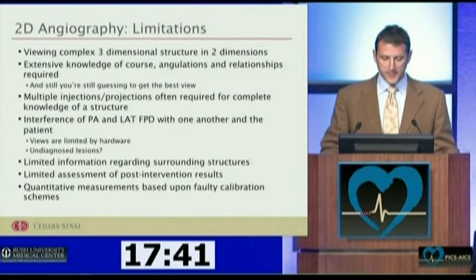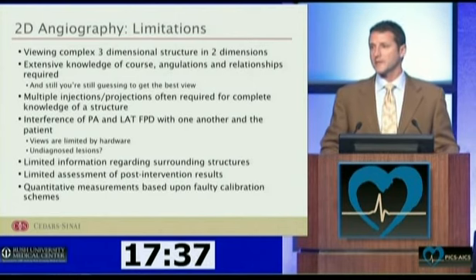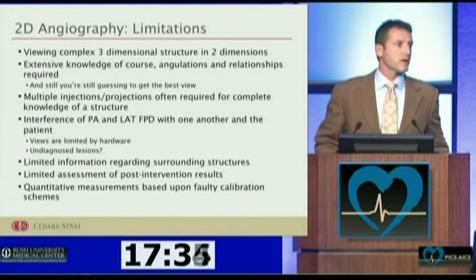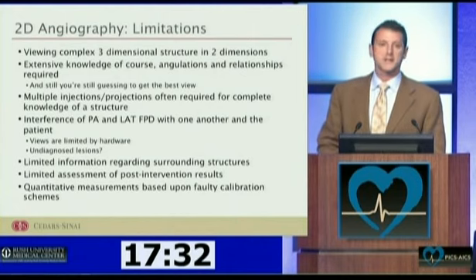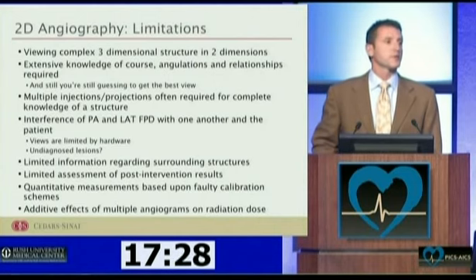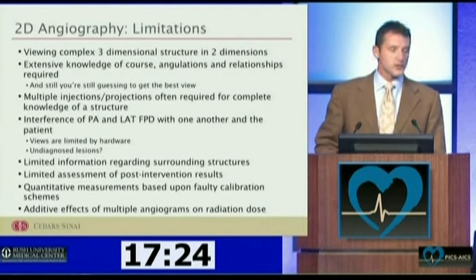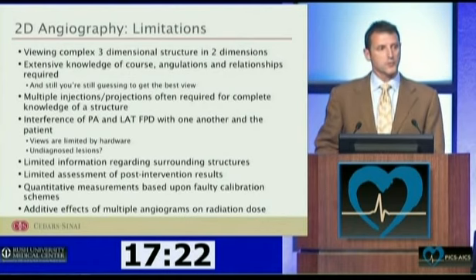Finally, quantitative measurements can be done, but they're based on, I think we could all agree, less than perfect calibration schemes which have been developed by necessity over the years. Finally, the additive effects of multiple angiograms cannot be underestimated in terms of radiation dose, especially on growing patients, children.